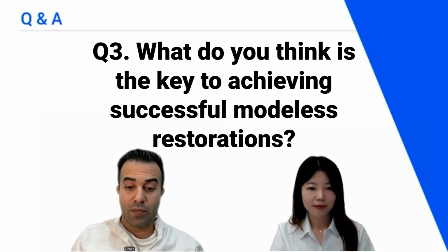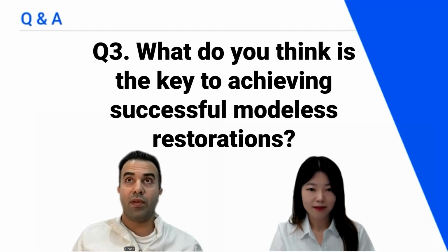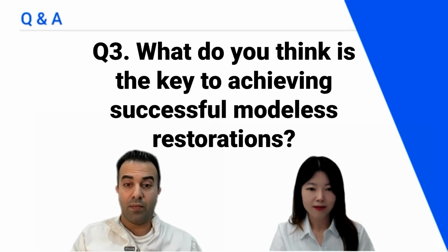However, model-less for single tooth posterior dentistry has its application. For example, the CEREC system is a model-less workflow. My personal preference, why I was away from model-less, is because I don't use milled ceramic restorations, I use pressed ceramic.